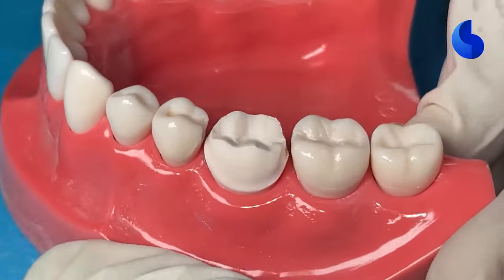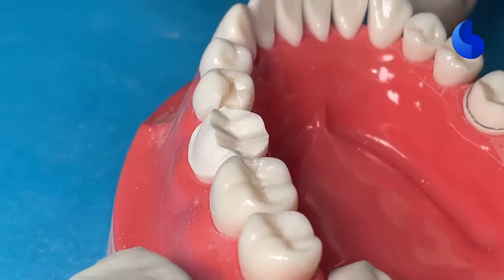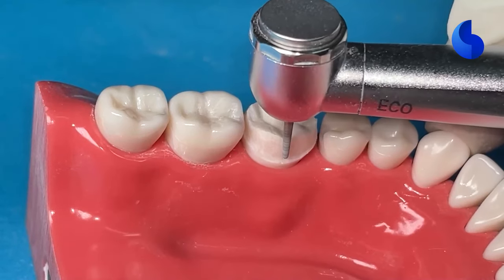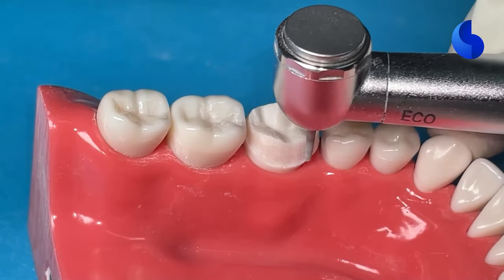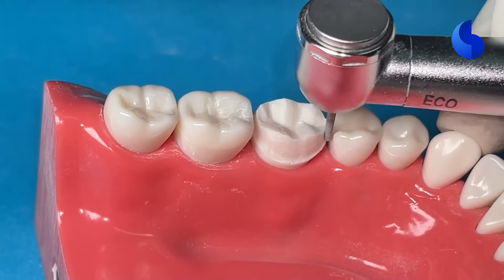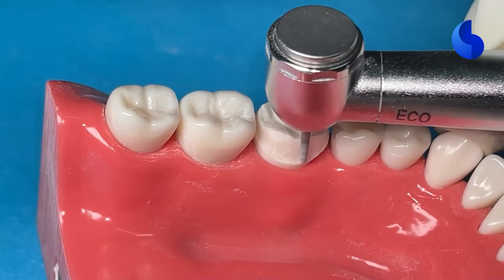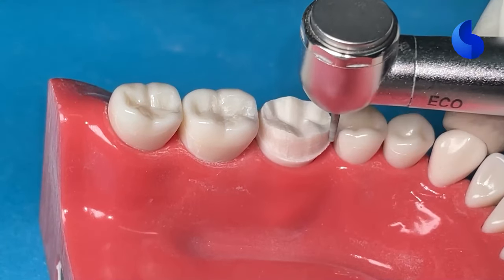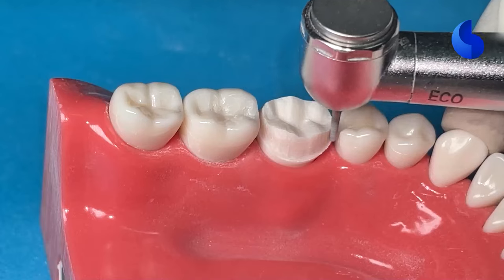And once you're happy with the buccal surface, you can move on to your lingual surface and start refining the margin on the lingual surface as well. So as you're refining and as you're smoothing things out, you can slowly move into the proximal surface and bring your margin a little gingival so that it's about 0.5 to 1 millimeter from your gingival margin.